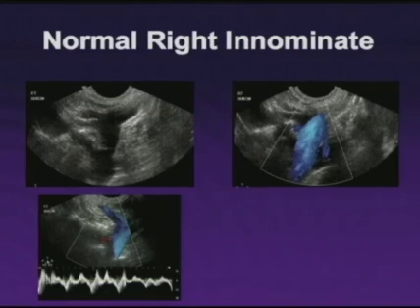Looking at some other waveforms, here the coronal orientation showing us the innominate vein. We can see the innominate vein here, the subclavian vein joining, and this structure is typically not the external jugular vein that we're used to seeing, but another vein, typically another anterior jugular vein. The innominate coming away from us, we see it filling completely in color, and our waveform shape showing again the difference in variation in velocity from respiratory change, as well as the superimposed greater changes indicating cardiac pulsation.